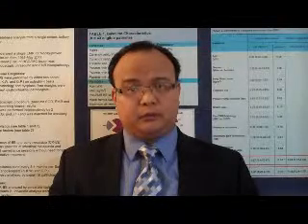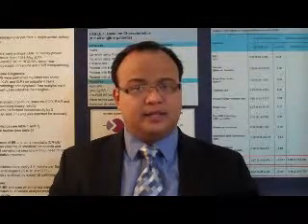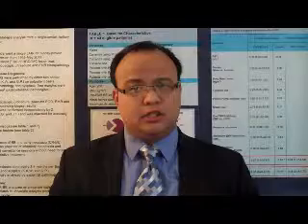Third, this is the first study as well to compare the inter-rater agreement and diagnostic performance of the two currently available endomicroscopy systems. That is the probe-based and endoscope-based systems. We have compared these two systems using their respective Miami and Mainz classification together with our newly proposed fluorescence intensity criteria. Based on our previous experiments, we have validated the increased uptake of 2-NBDG in dysplastic esophageal cells.